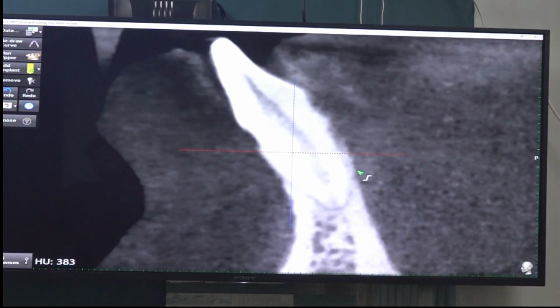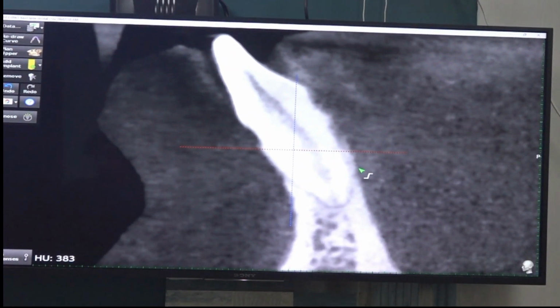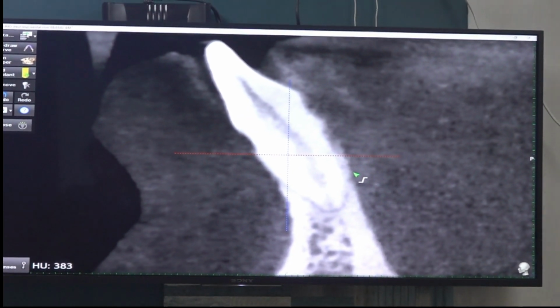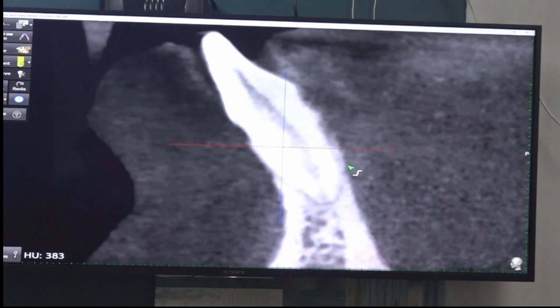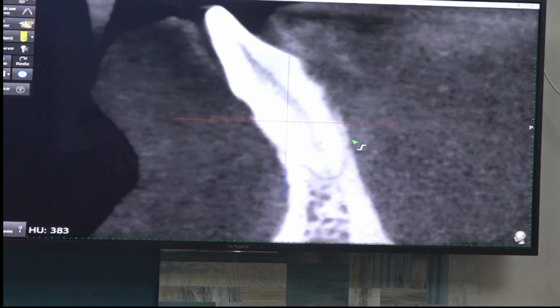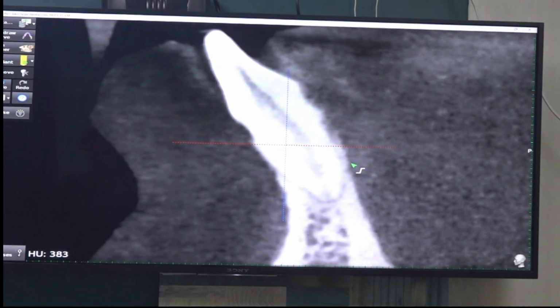So I saw the clinical picture for this patient. The prosthetic space is quite decent. There is no need to do alveoplasty. When there is no need to do alveoplasty, there is no need to open the flap. Of course, if you want to see the buccal and lingual bone for access and visibility, you can open the flap, that is okay. But for the sake of doing alveoplasty, there is no need. The clinical picture is there.